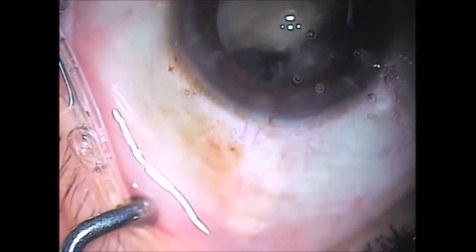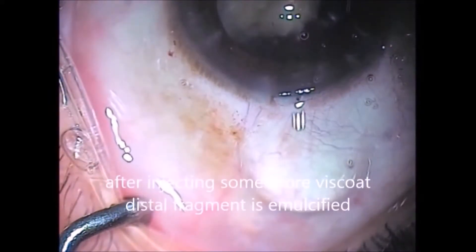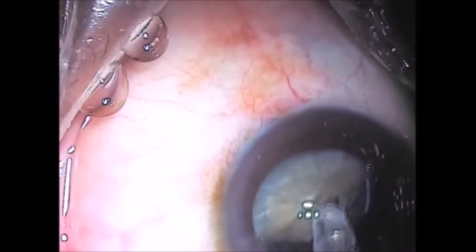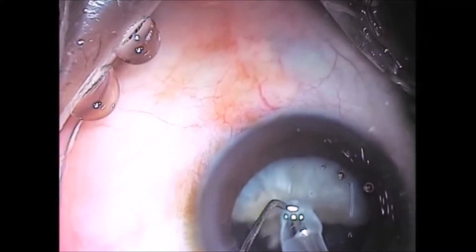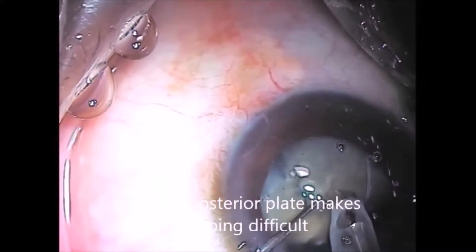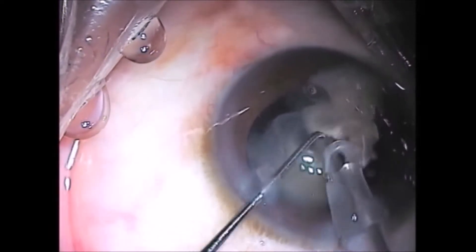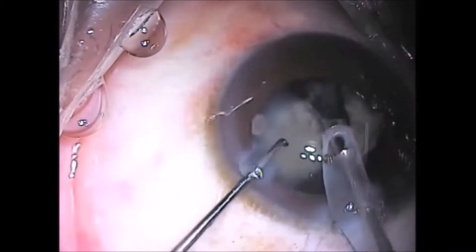Now, as you can see, one hemi-nucleus has disappeared behind the iris. I take a deep breath and put a lot of dispersive viscoelastic. I start emulsifying the visible hemi-nucleus.